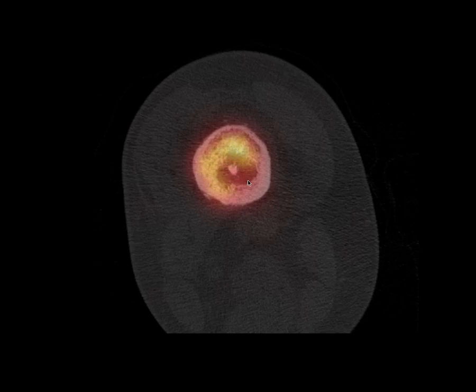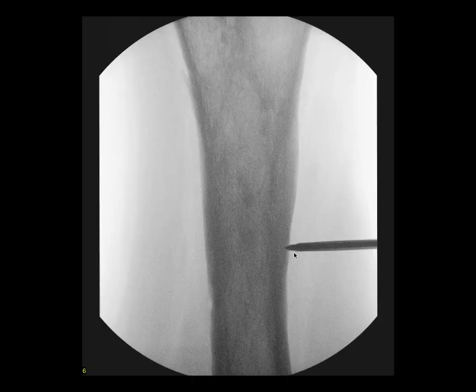The patient had pain, so it was decided to perform a biopsy, see if any culture could be obtained. It's often very difficult to obtain a culture of the organism in chronic osteomyelitis. Here we are, the surgeon is preparing for their biopsy, and they did indeed perform a biopsy, but unfortunately no organism grew, and the patient hasn't had further investigation for two reasons. One, because they're feeling quite well, possibly due to the fact that the bone has been decompressed during the biopsy. They got a sudden improvement in their symptoms, but also they're not being investigated further because they're feeling okay and we're in the middle of the COVID-19 pandemic.